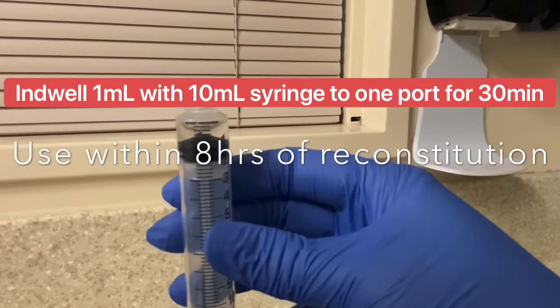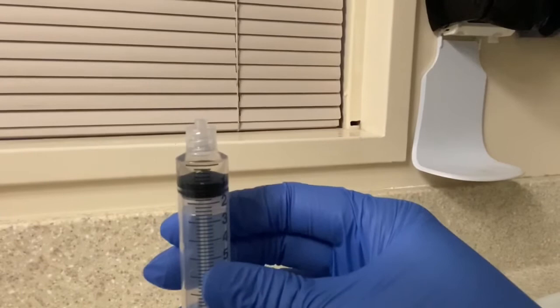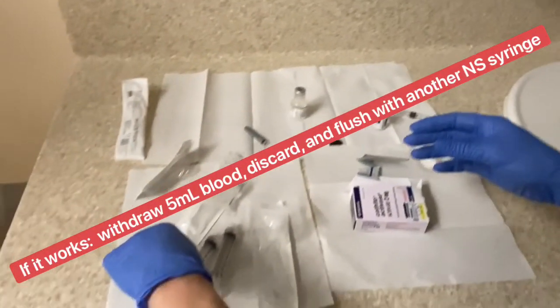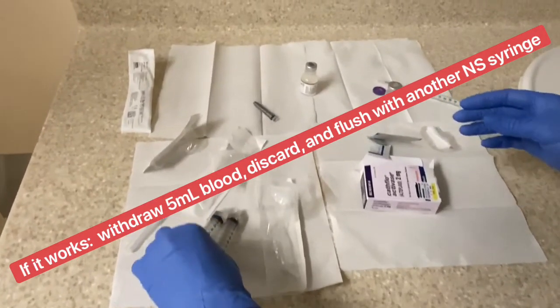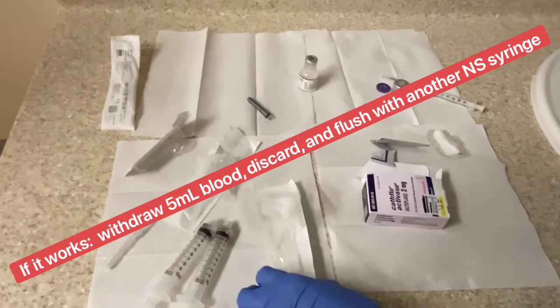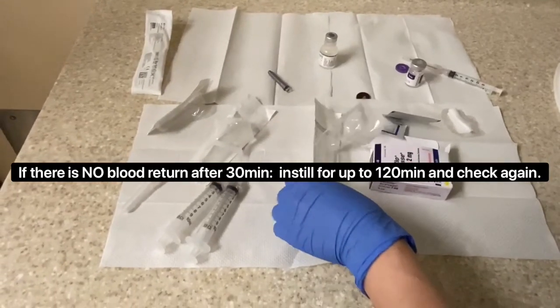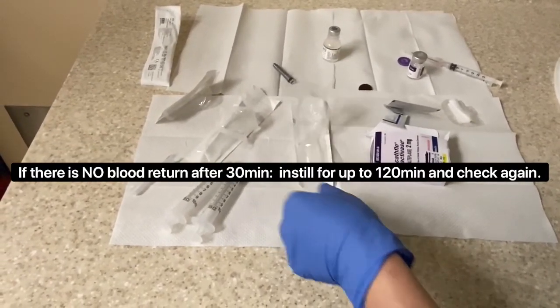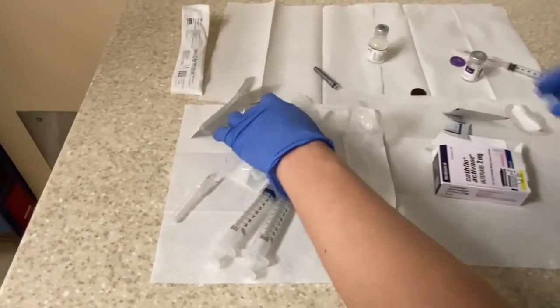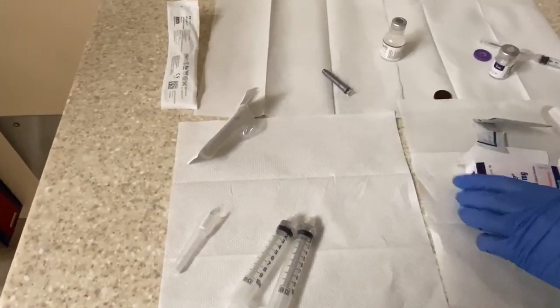You indwell the 1 ml final cathflow solution into each port for 30 minutes, then check for blood return. If there is blood return after 30 minutes, go ahead and withdraw 5 ml of the blood-cathflow mixture — don't inject it back into the patient — then discard it and flush with 10 cc of NS. If it doesn't work after the first try, you can indwell the same cathflow for 120 minutes and recheck. If it works, do the same: withdraw the blood and flush with NS.